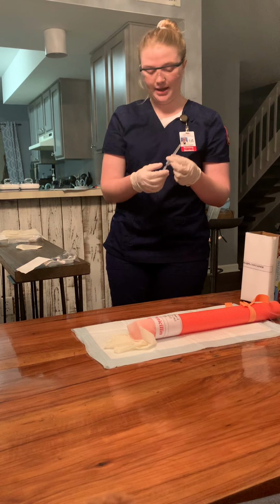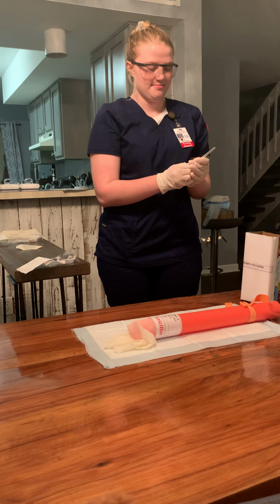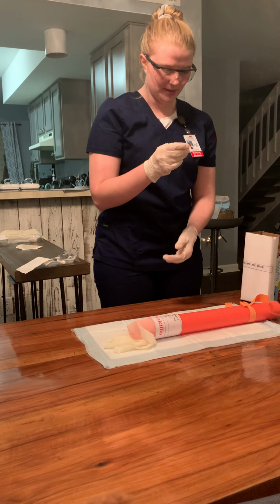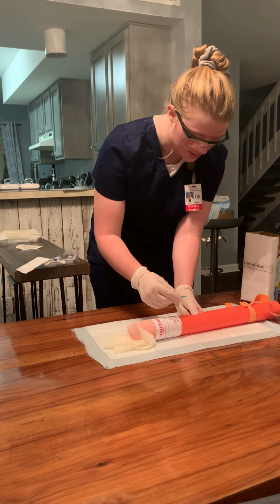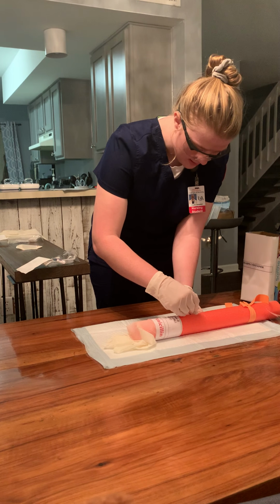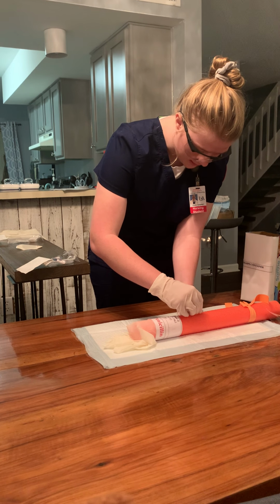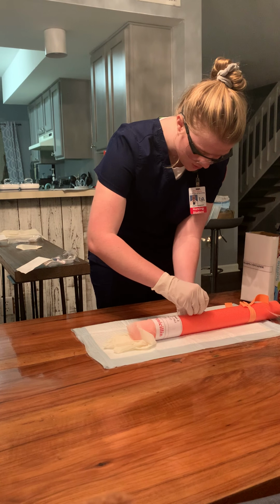I'm going to grab my over the needle catheter, or grab my needle and my catheter, and then dispose of the cap. I'm going to anchor the vein, making sure not to touch where I just cleaned. And then I would insert, bevel up at a 30-degree angle until I saw blood return. And then I would lower the angle and go another 1/4 inch.